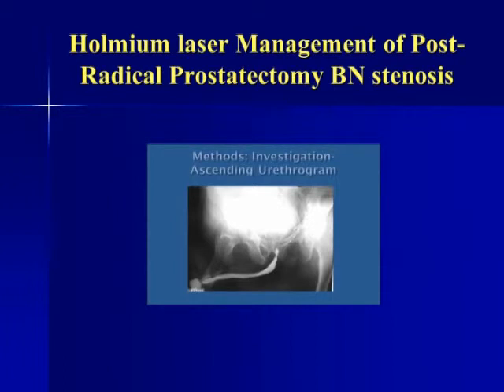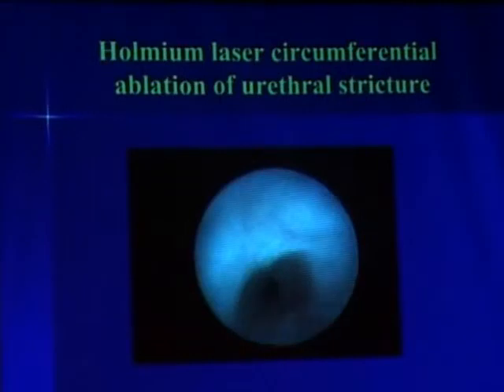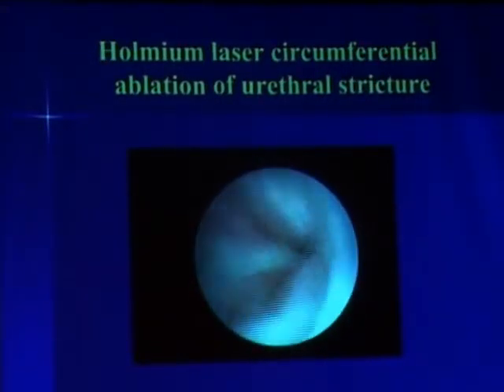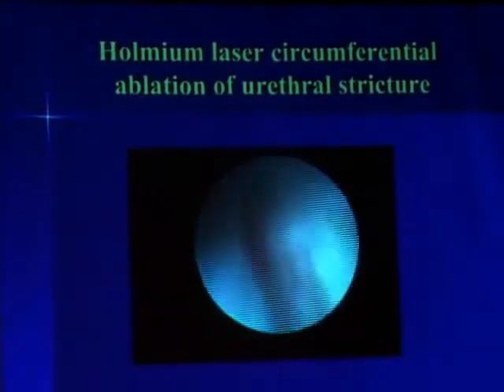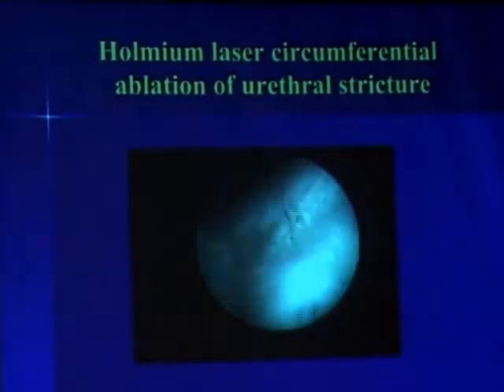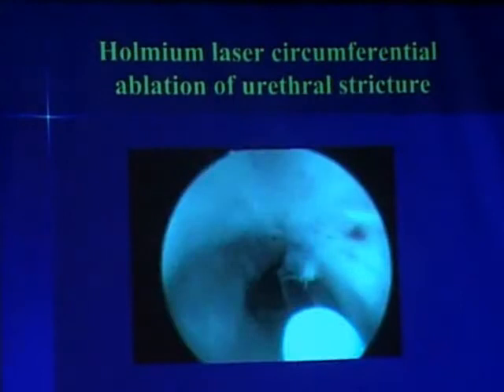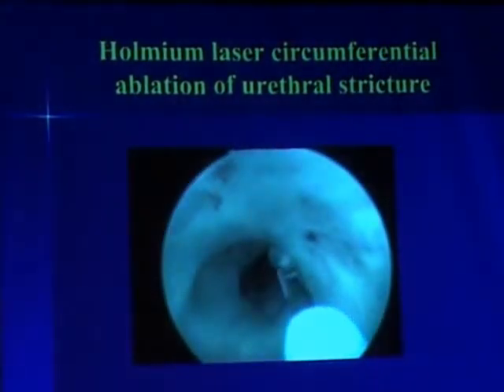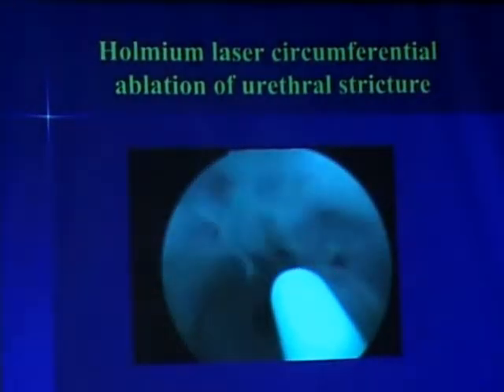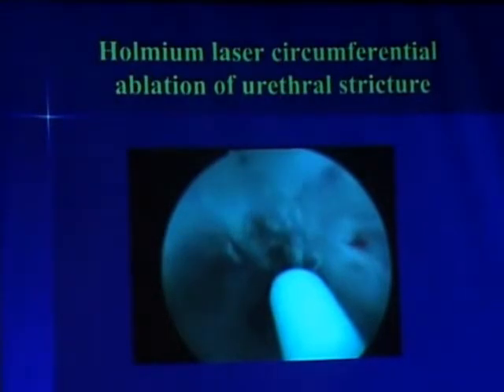The same thing can be done for post radical prostatectomy bladder neck stenosis. This is what we do for strictures. We ablate the stricture circumferentially, resect all the adenomatous, fibrous tissue all around, to leave a supple spongy tissue behind, decreasing the chances of probable restenosis. Again, the bleeding is very minimal, and initially we incise the tissues till we see spongy tissue, and then we try to resect the fibrous tissue.